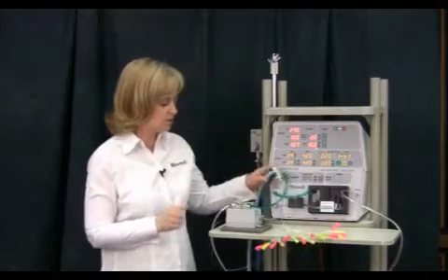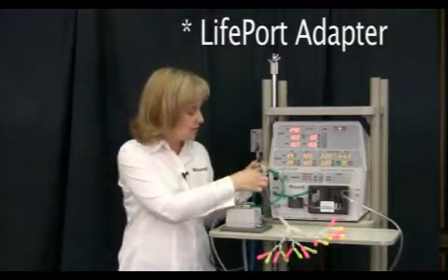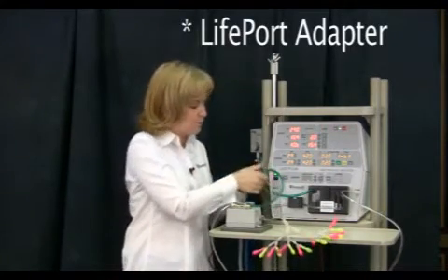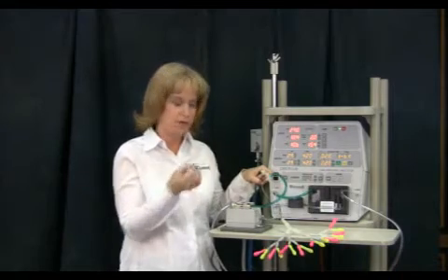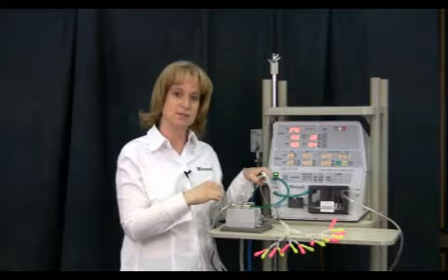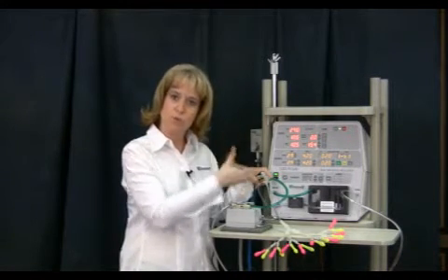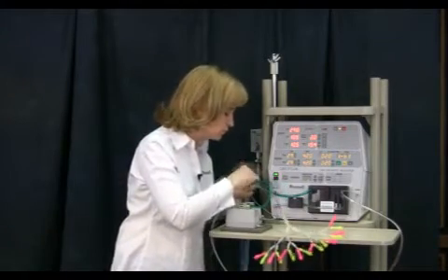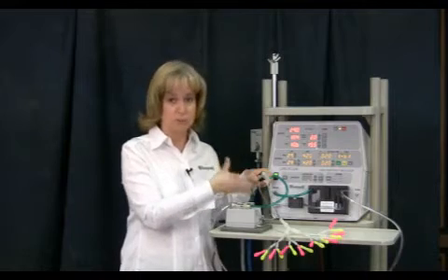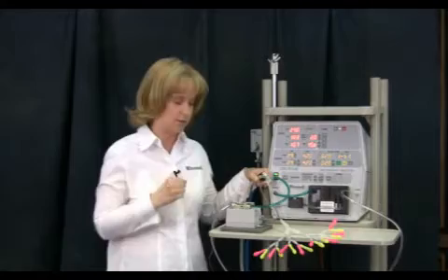Another thing to think about, and don't ever forget, is your little life port adapter. There's room for error here. Let's say somebody came up and put this on too tight and actually cracked it. Then we've got a little bit of leak going on there that you may not be able to see. So always inspect this and make sure you can rule it out. You can change it out if you're getting big fluctuations. It's a very disposable piece, so please do change it out. We'd rather you do that than start changing your circuit.